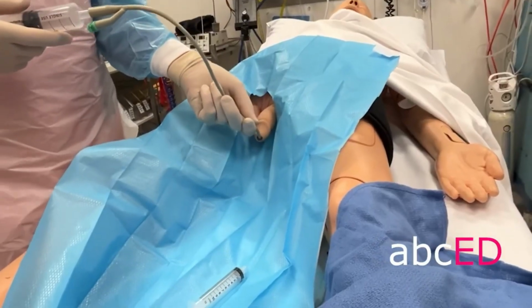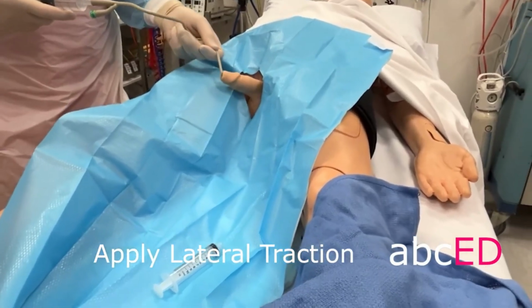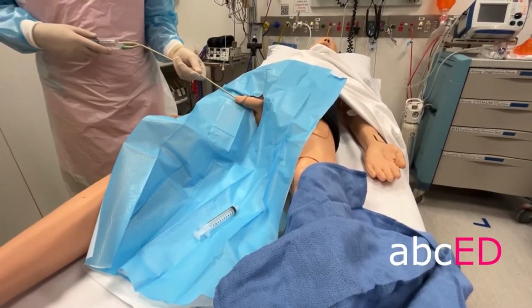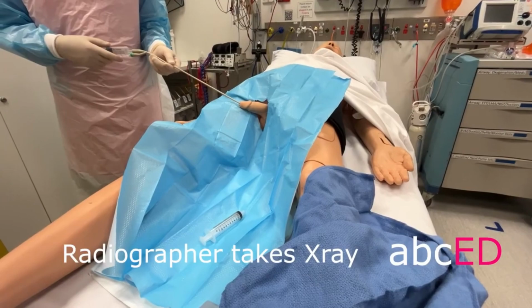Apply gentle traction to the catheter laterally to move the penis into an oblique plane. Move your hand out of the way and take the X-ray.